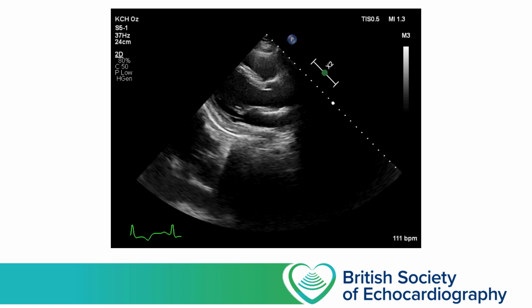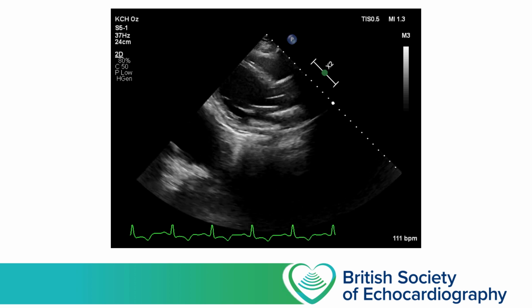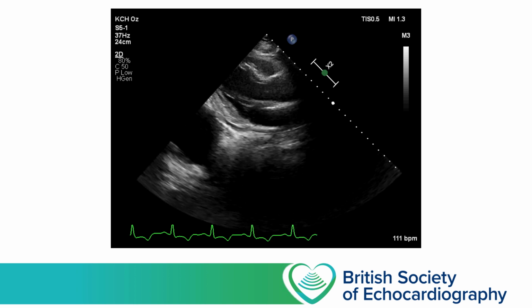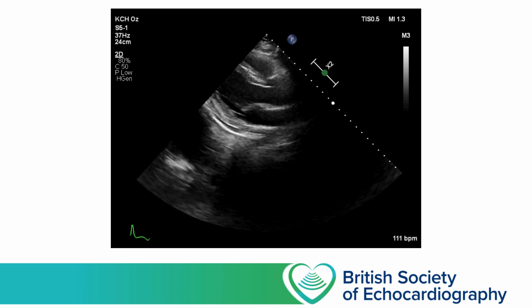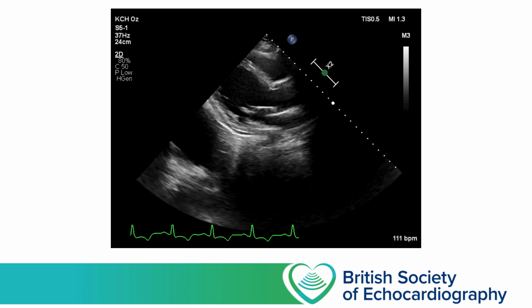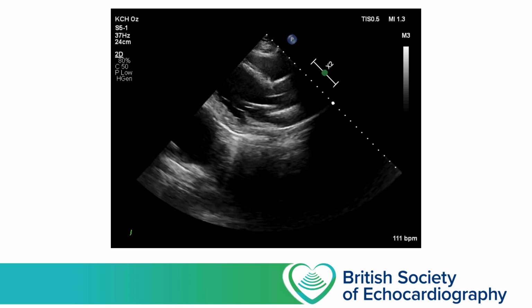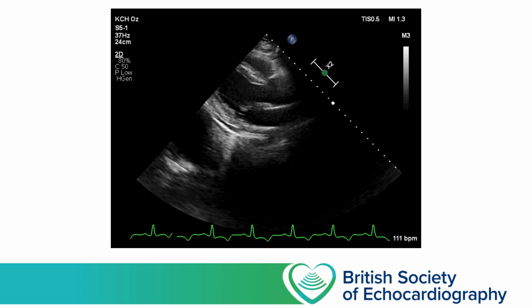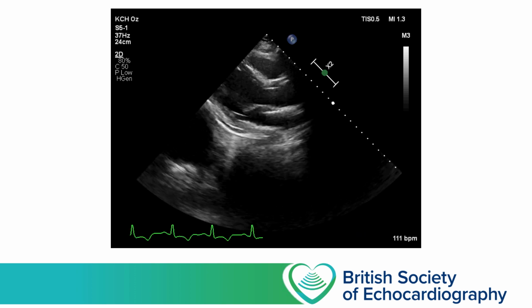So with the ultrasound system set up as it is, we've got a frame rate of 37 frames per second, 37 Hz, and you can see that information displayed in the top left hand corner. Now that's a reasonable frame rate, but given this patient is tachycardic, that's not leaving many frames per cardiac cycle. In addition, our lateral resolution is going to suffer because our line density won't be that high.